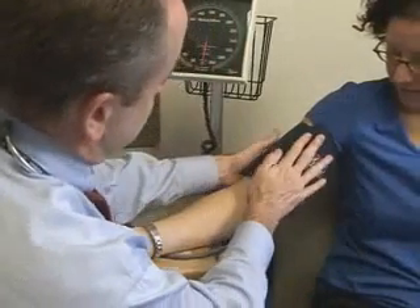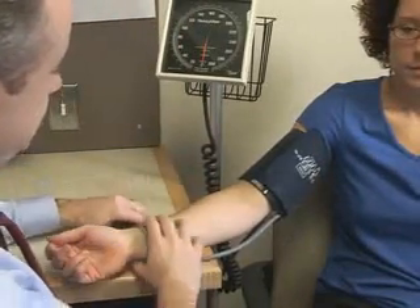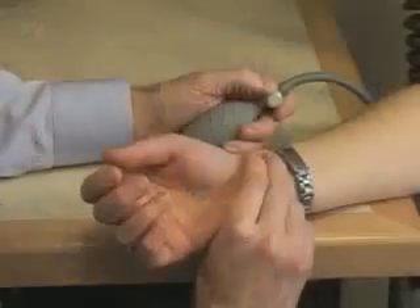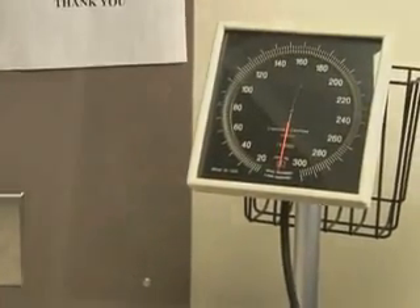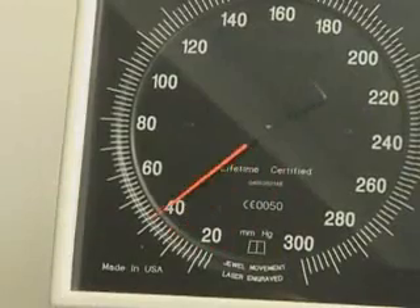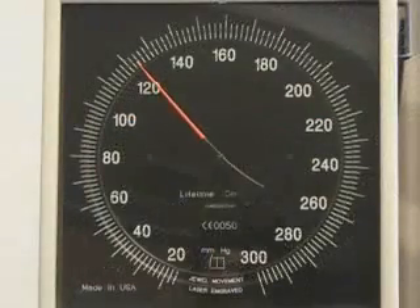In the following example, the patient's blood pressure is 116 over 90 mmHg. You will hear nothing until the first Korotkoff sound appears at 116 mmHg. The various phases of Korotkoff sounds will be heard until their disappearance at 90 mmHg.